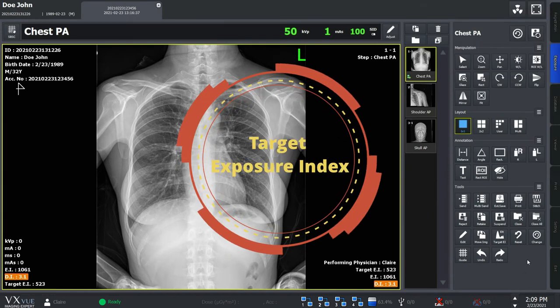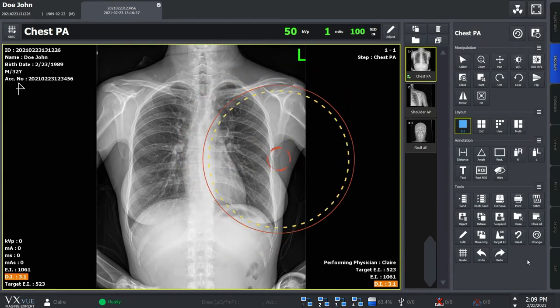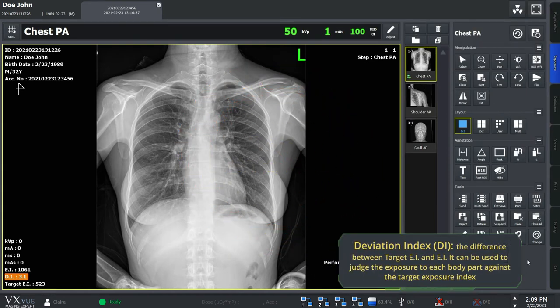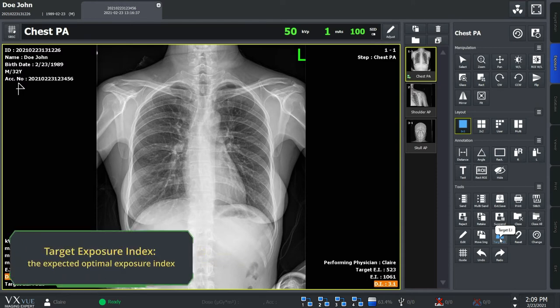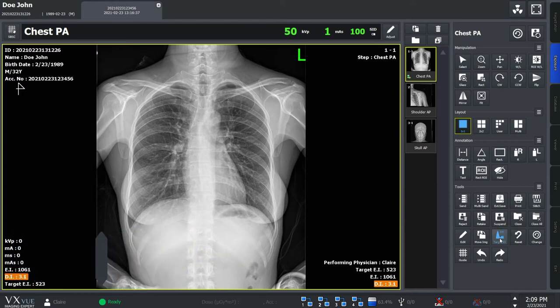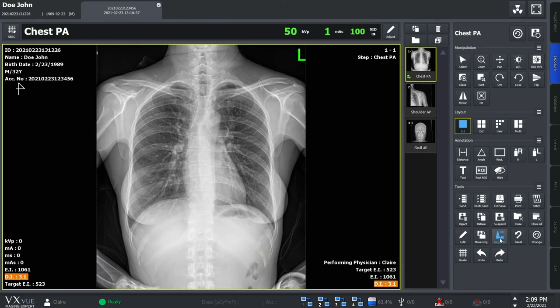VXView supports exposure index and deviation index, which would help you control and absorb dose. From the tool section, you can see the target exposure index icon. Target exposure index is an expected optimal exposure index and you can change it by clicking on this icon.